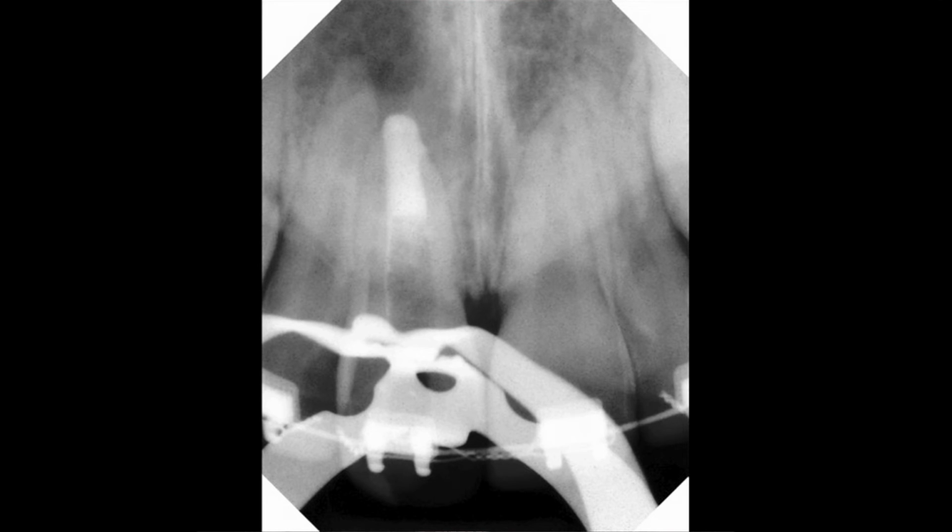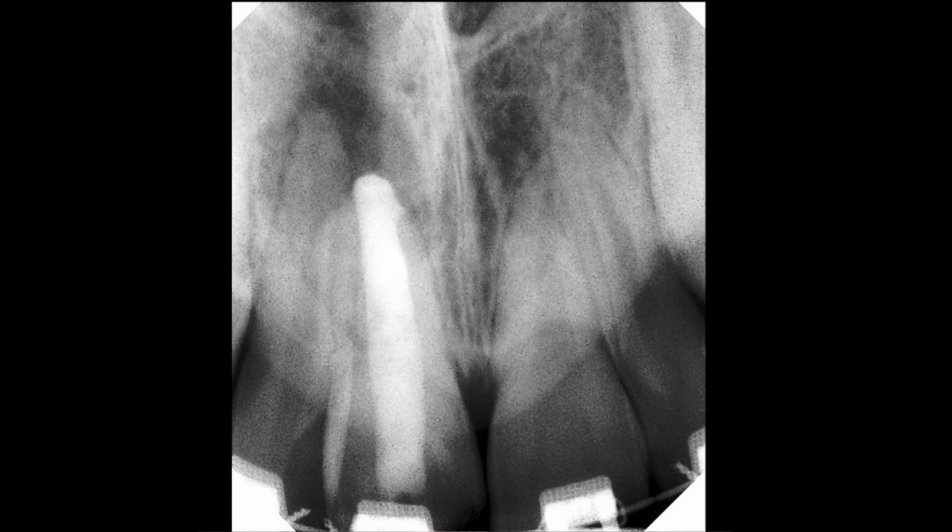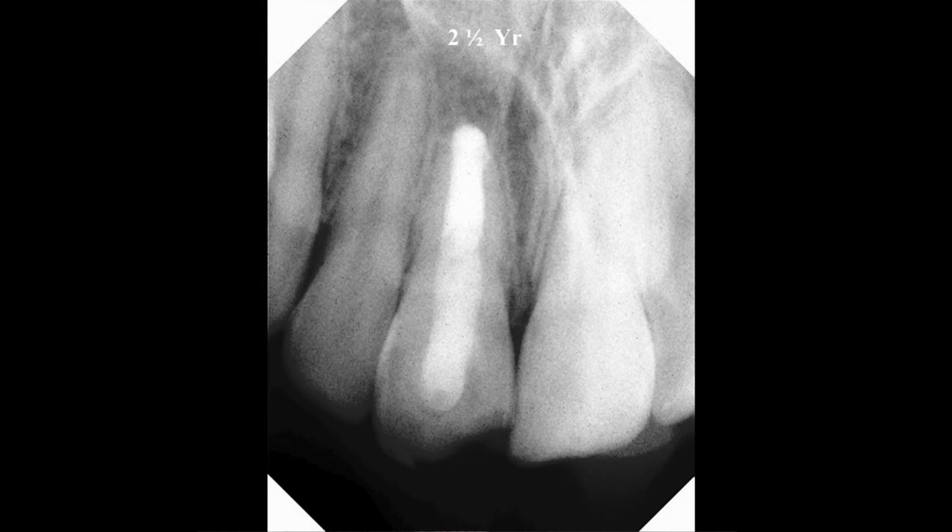After the tooth is cleaned thoroughly in a routine endodontic manner, the apical plug of MTA is placed and the remainder of the canal is filled with a bonded composite in order to strengthen the root. And then here is that case 2.5 years later, showing resolution of the apical lesion and retention of the tooth.